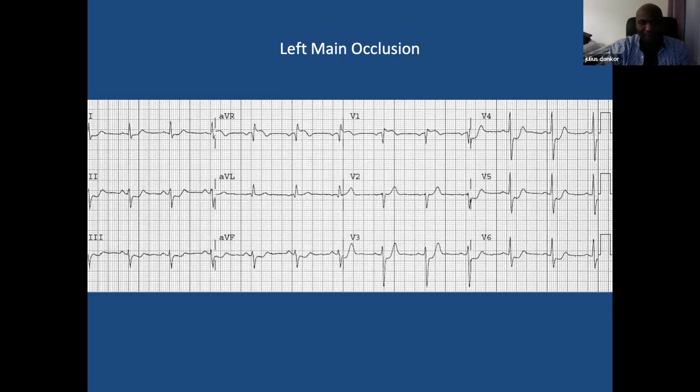So yeah, that's fine. You can also get exactly this particular ECG pattern with triple vessel disease as well. So there's extensive disease in your coronary arteries. Is it left main or triple vessel disease you can get with this one? Widespread ST depression, and you're looking at V1, usually ST elevation, and AVR as well, ST elevation.